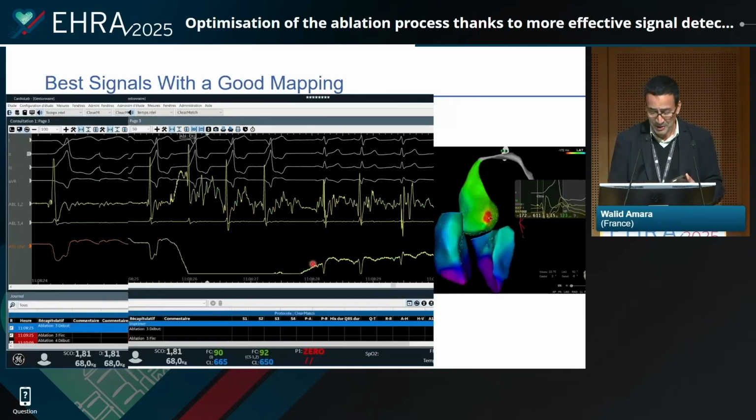And even here, when you look at this ventricular extrasystole coming from the aortic root, it looks very nice, but if you look at the potential, you see that it's very early here, and that means that I ask my engineer to target the beginning here and not to target all this signal. At the beginning, the map showed the most precocious point here, and when I asked, it modified the map. That means what I see will modify the way the map is done.